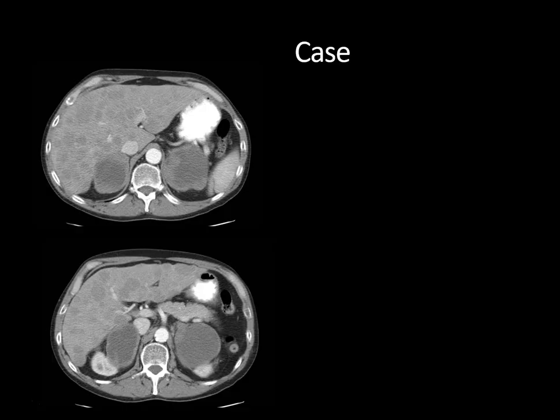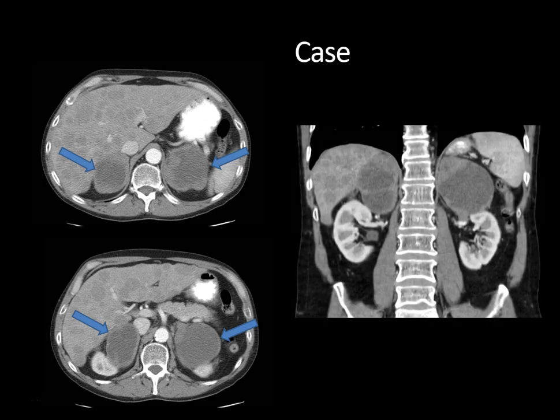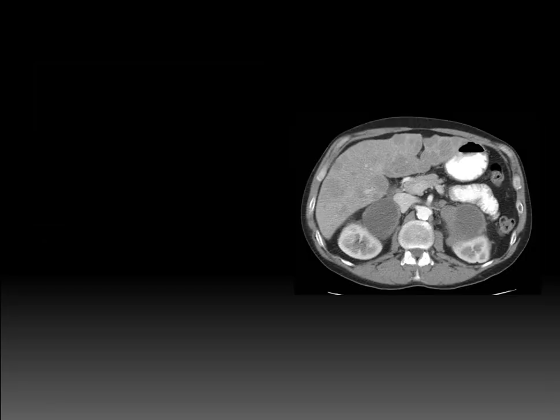Starting with a case. This was a CT scan of the abdomen with intravenous contrast through the level of the adrenal glands. You can see these two large mixed cystic and solid masses in the region of the adrenal glands bilaterally. On the coronal reformatted image, you get a sense of their large size and the mass effect they exert against the underlying kidneys. There are also multiple ill-defined hepatic metastases.